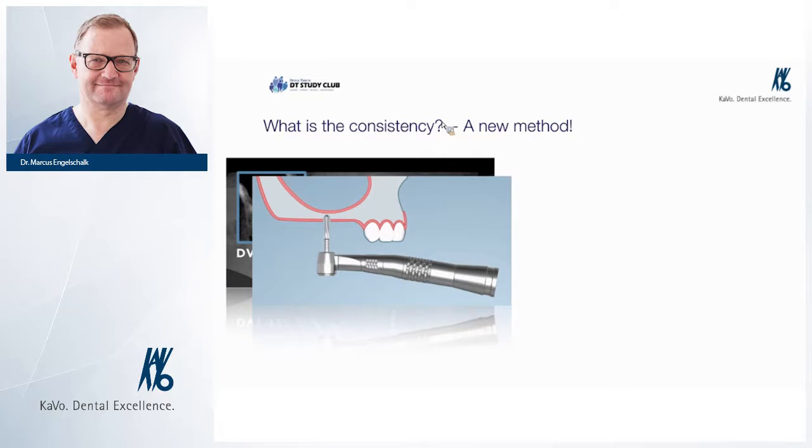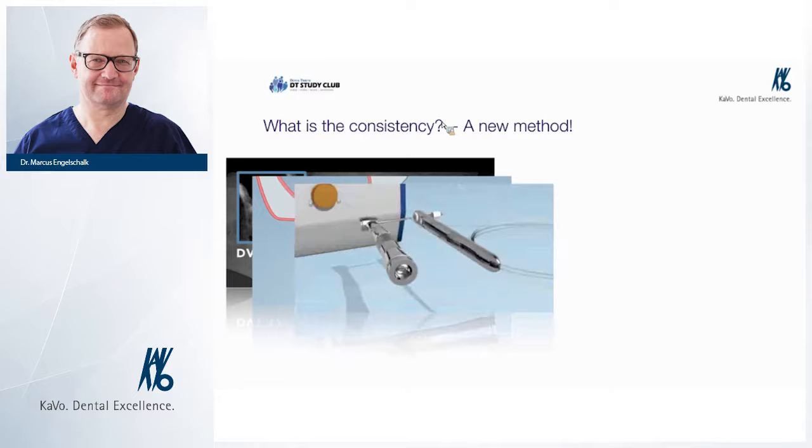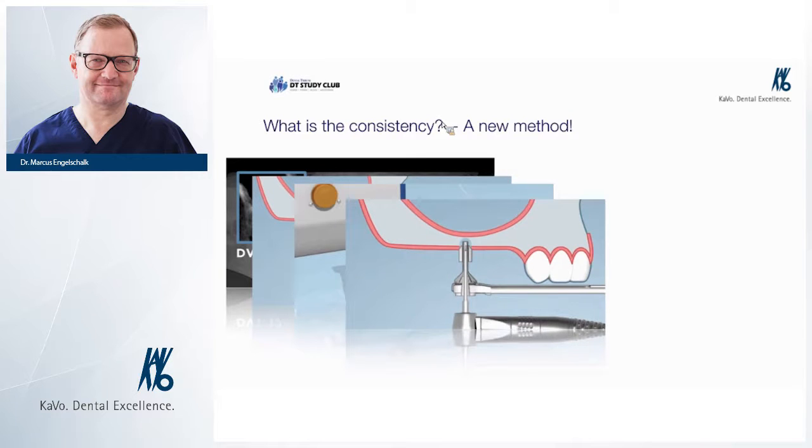132.6% of its original size in one-dimensional elongation. Well, that's much. Or 124.7% in two-dimensional elongation. Well, that means it's very important to have a healthy membrane. So this is important for your X-ray before the operation, to have an estimation if there is a healthy 1 millimeter thick membrane or not.